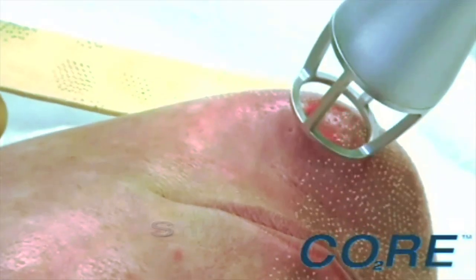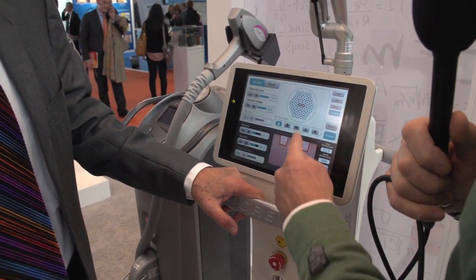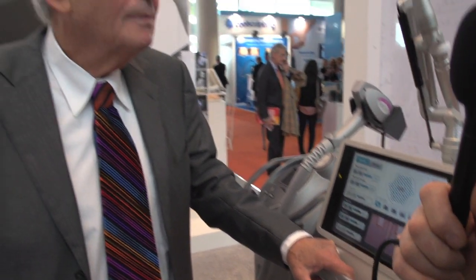So you get a combination of both getting the growth of new collagen, as well as the fact that you clean up the upper surface of the skin in one treatment. So the wider blocks, as we can see here, is more to remove the hyperpigmentation, whereas the deeper ones activate the collagen reconstruction of the dermal layer. Exactly. This is the way it is being done.